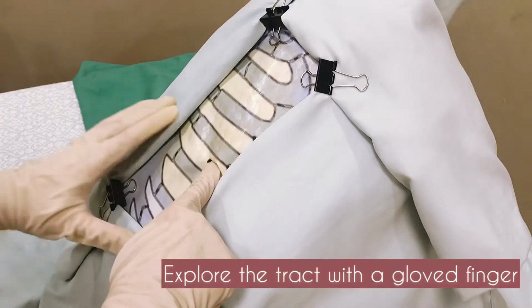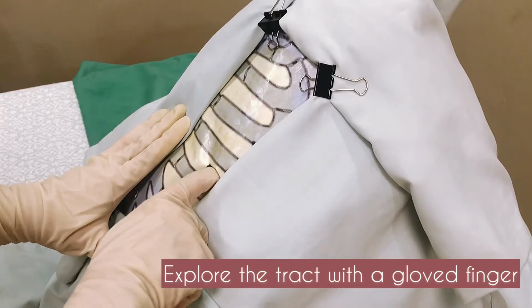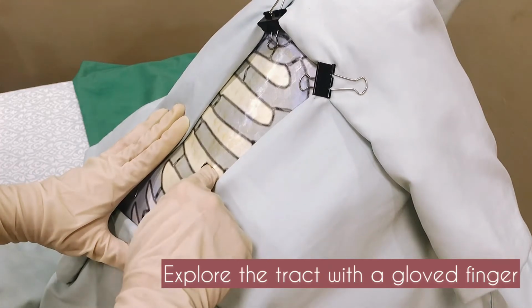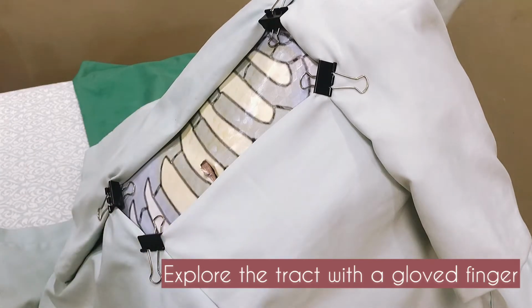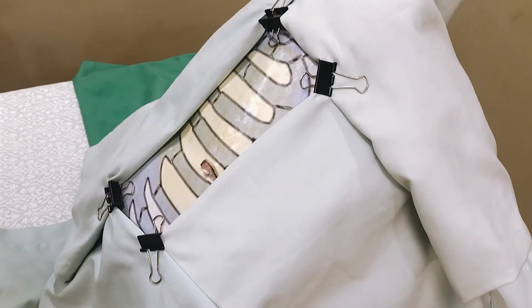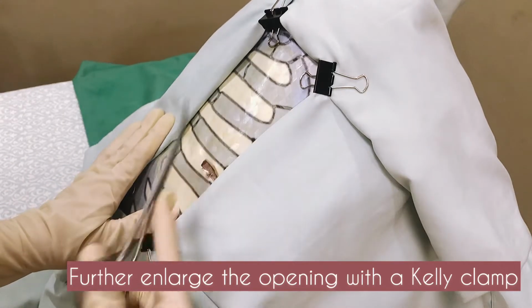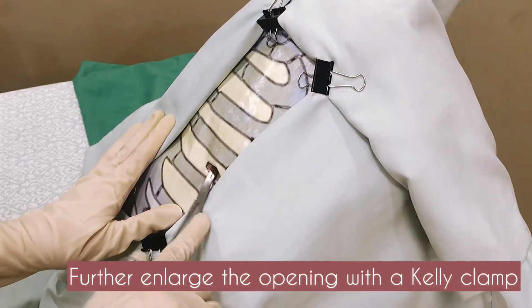Remove the scissors or clamp and explore the tract with a gloved finger from time to time to make sure that the tract is going in the right direction. After the pleural cavity has been entered, insert the gloved finger to explore for adherent lung and then further enlarge the opening in the pleura by inserting a large Kelly clamp and spreading it.